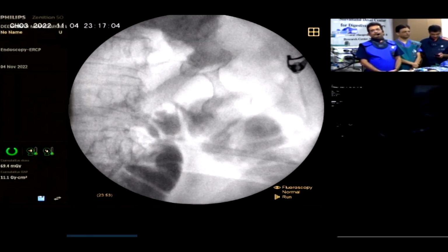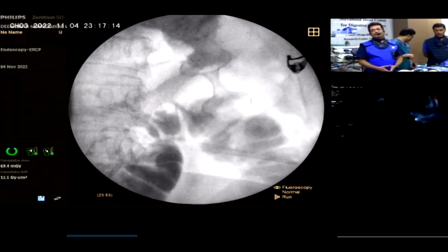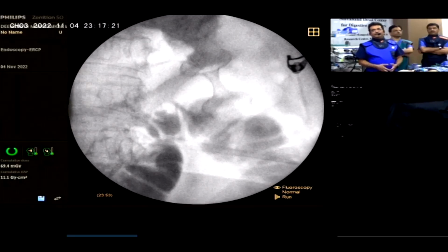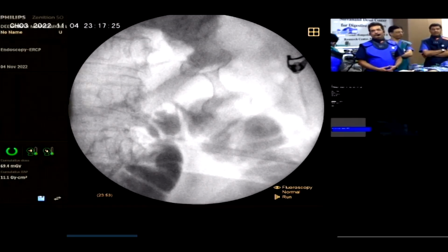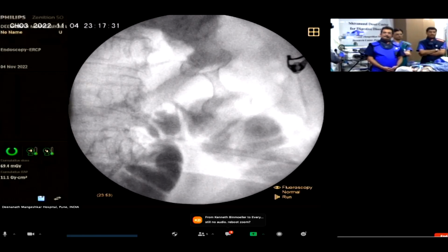See, the surgeons do a GJ of 20 to 30 millimeter in size. So if you want to emulate that, you at least need the 20 millimeter stent. If you're doing anything smaller, you're just undercutting it for no reason. From a technical standpoint, there is really no difference using a 15 versus a 20 millimeter stent. So why use a smaller stent when you have a larger stent that is available? That is my take on that.